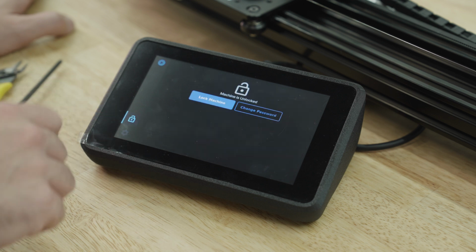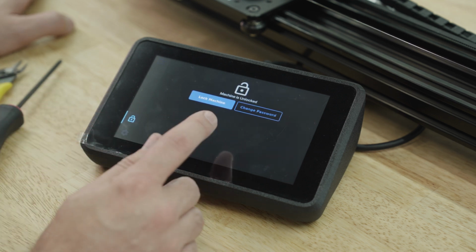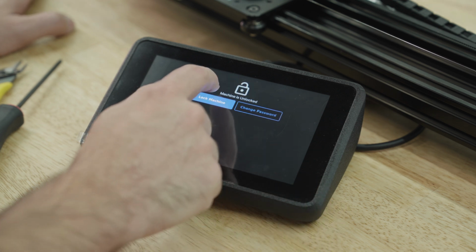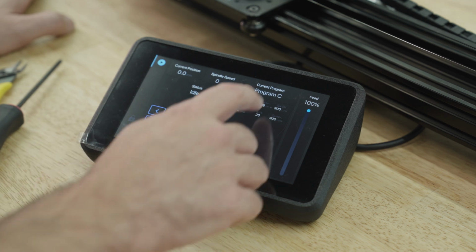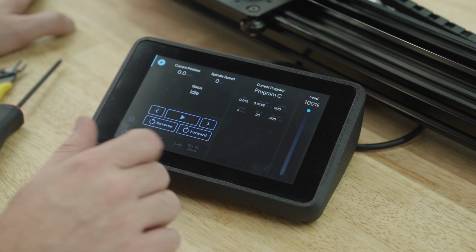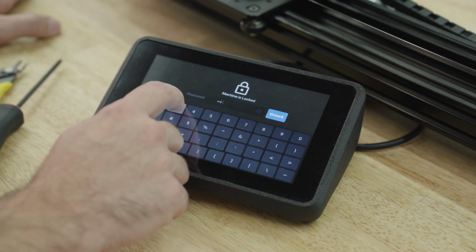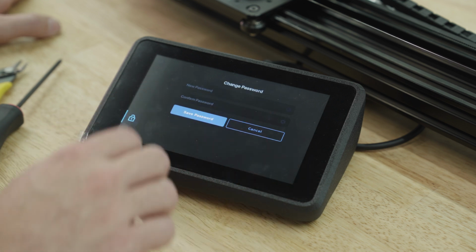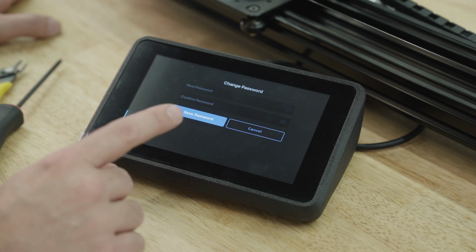The next screen I want to talk about is the lock screen. You can choose to lock the machine or change the password. By default, the password is 1234. Let's go ahead and lock the machine. When the machine is locked, you cannot edit the programs or change the programs, only execute them. To unlock the machine, just type in your password. 1234, unlock. You can change the password, and it can be any alphanumeric string that you'd like. Just remember, don't lose your password.